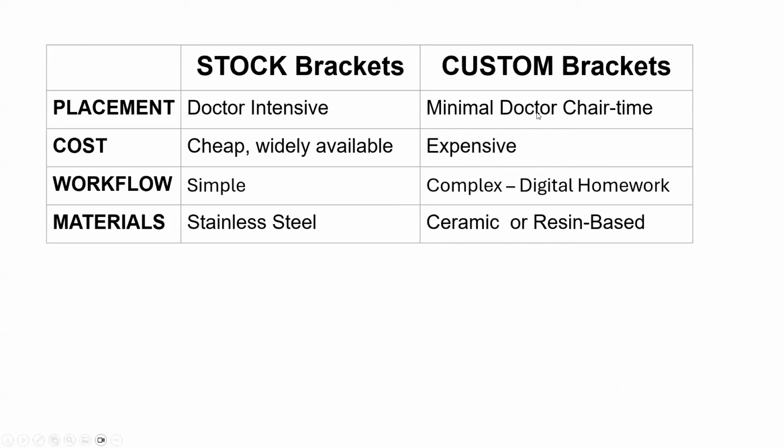Custom brackets, very minimal doctor time. We go through our start cases in the morning where they pull up the DIBS, we pull up the treatment plan. I tell them where our bite protection is going to go, what type of bite protection to use. We go over elastics that we're going to run, everything. When the case is done, I'm checking the quality of the transfer, checking for any flash that they may have.